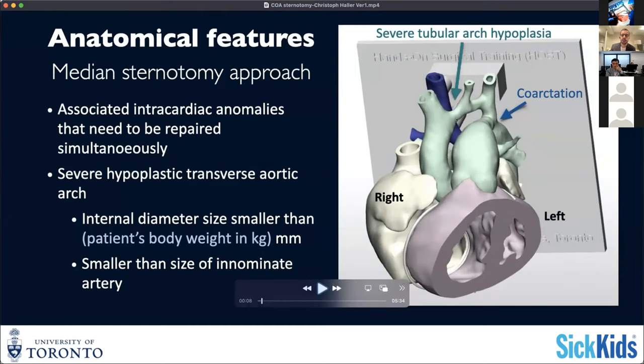You see that the arrows are pointing again at that typical segment that I've been mentioning multiple times - this is not going to be sufficiently addressed with an extended end-to-end repair. Therefore you need to enlarge your aortic arch more aggressively.